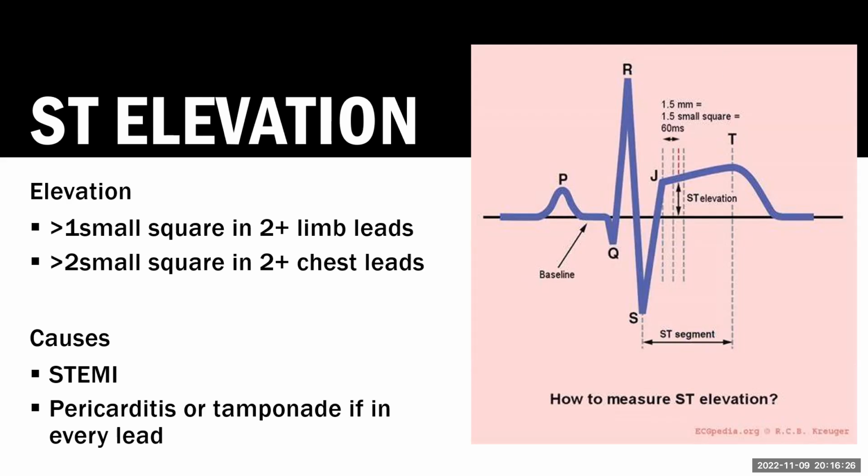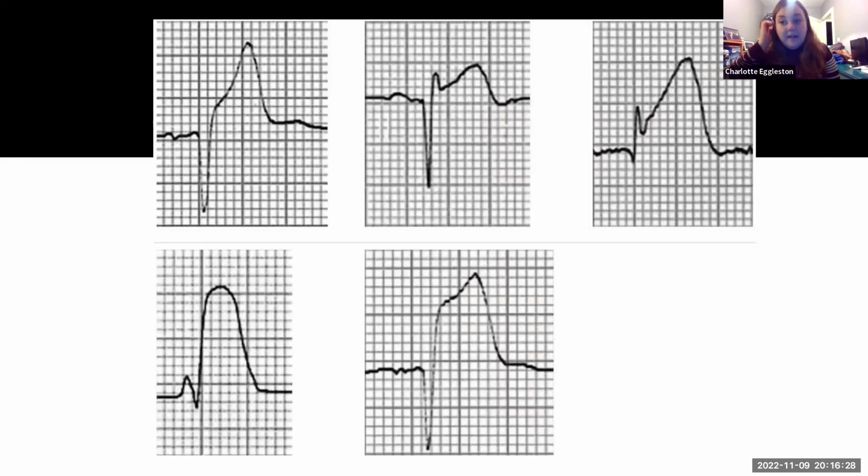That's all right. So ST elevation can look all sorts of weird different ways. And sometimes you'll be doubting yourself, is that ST elevation, is it not? Obviously, some of these are quite obvious, but I tend to get a piece of paper and have a look to see if it's all the same baseline or if there is a rise from the baseline.